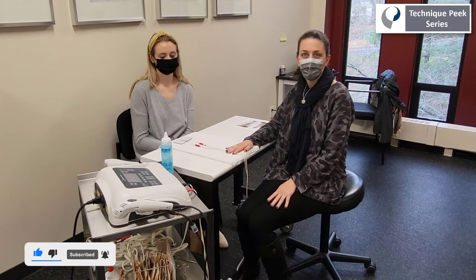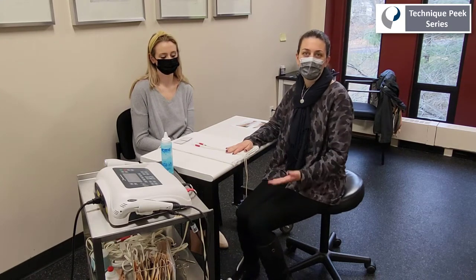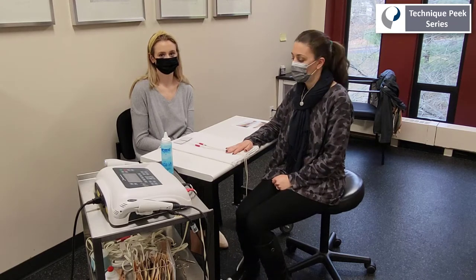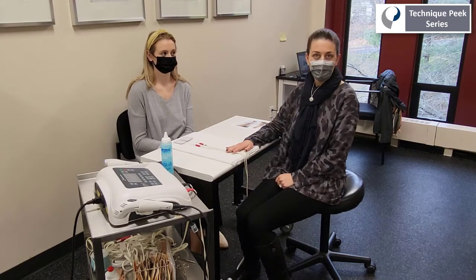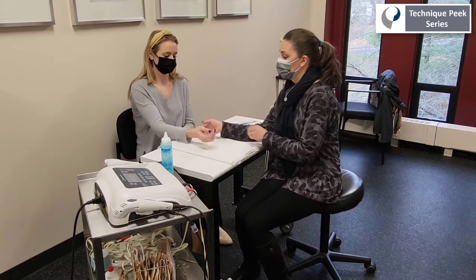We can use basic anatomical landmarks to guide us to the general vicinity of a target muscle or tendon, but with some smaller muscles, especially those that are less superficial, it can be difficult to place our electrodes in the correct location to facilitate the desired motion.